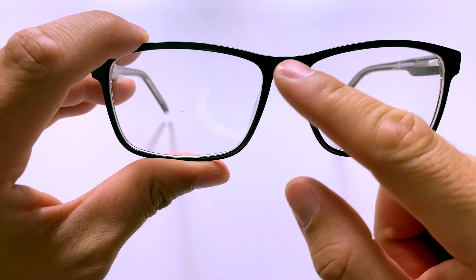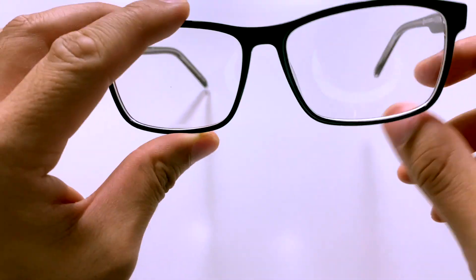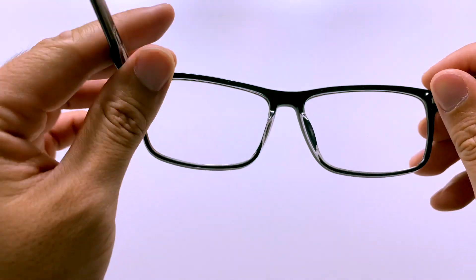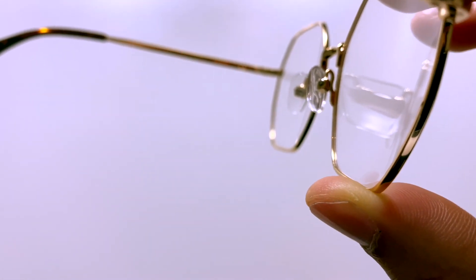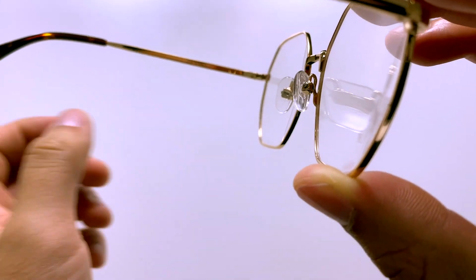Now let's take a look at the front of the frame. The front face has an area called the nose pads to hold the glasses up on your nose. The nose pads can be made out of plastic embedded in the frame, a wire holding plastic, or silicone pads at the end. Sometimes the nose pads on a metal frame can cause indentations on the side of your nose. If this is happening, I recommend you visit your nearest optometrist to ask them to switch to a silicone nose pad, or replace it with an acetate frame, which has more surface area to distribute the weight.